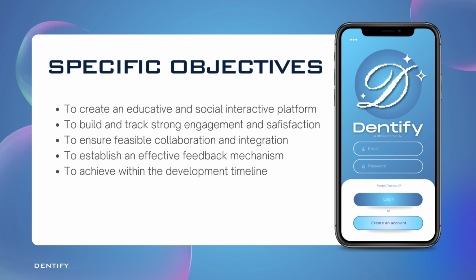Dentify integrates software, hardware, and peopleware, collaborating with university stakeholders, the faculty, IT staff, and students to ensure compatibility and efficiency. Training will empower users to fully utilize and maintain the system. Fourth, to establish a feedback mechanism.